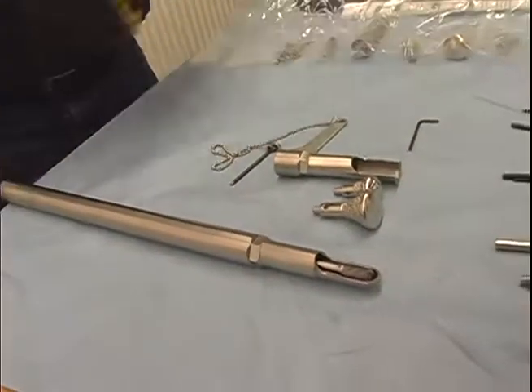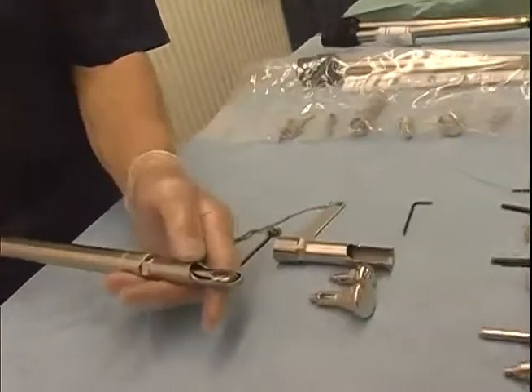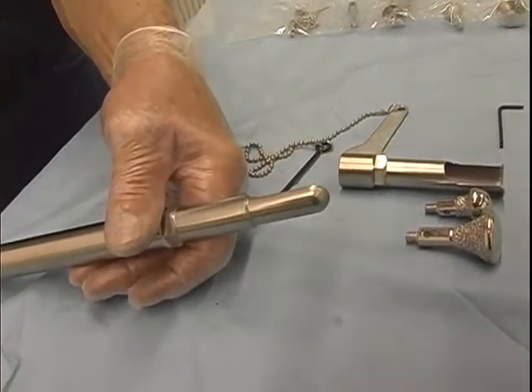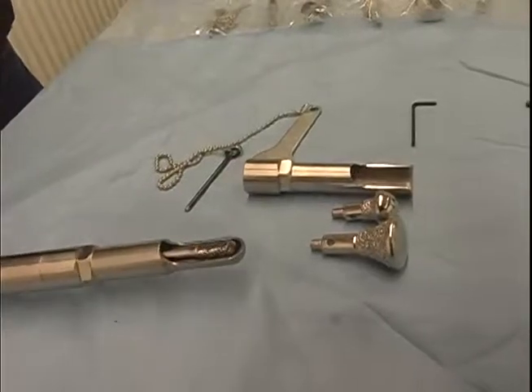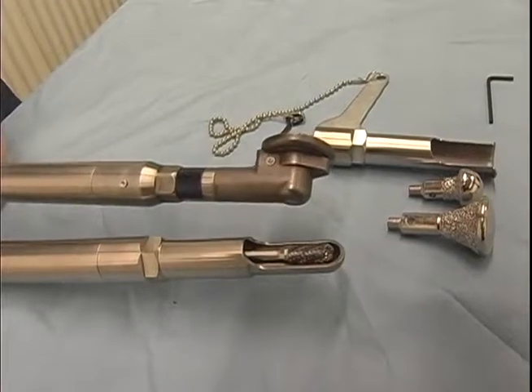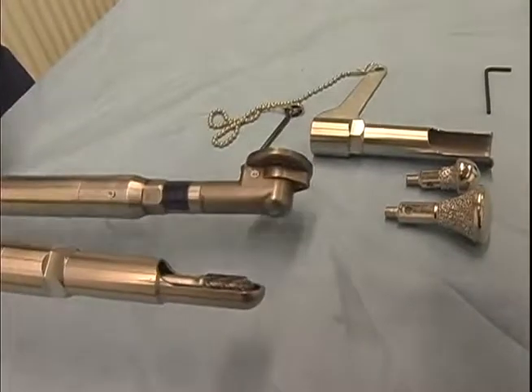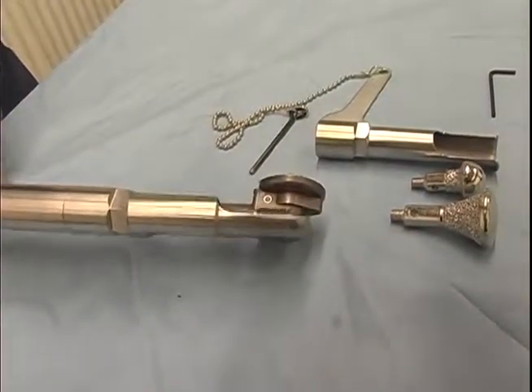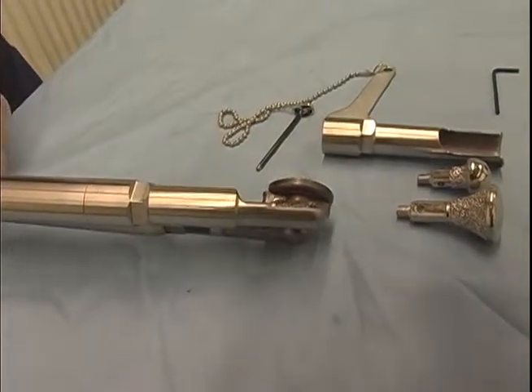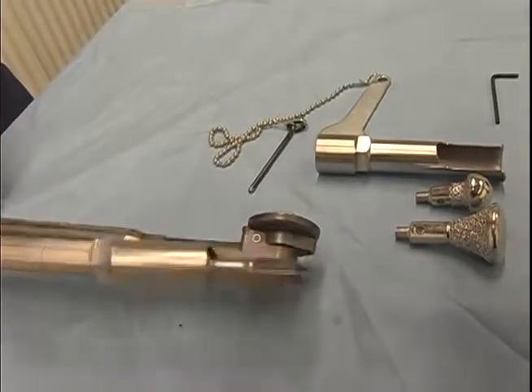So we now have a guarded rotary burr that is approximately 3/16 of an inch in diameter. You can see it has a very narrow height to it. In the back of the mouth of a miniature horse, if we're trying to float the back teeth, we would be looking at a distance that high, and it gets very tight in the back of the mouth of a miniature. You can see that this rotary burr is a third the height approximately, and there's enough room to get this burr into the back of the mouth of a miniature horse or a miniature donkey.